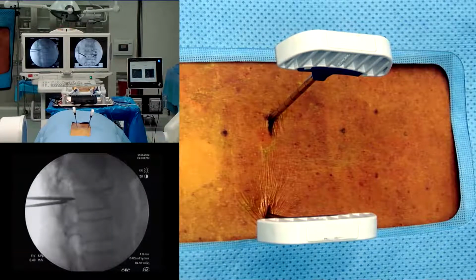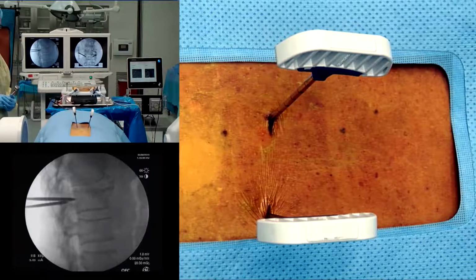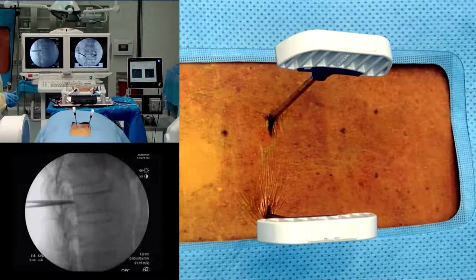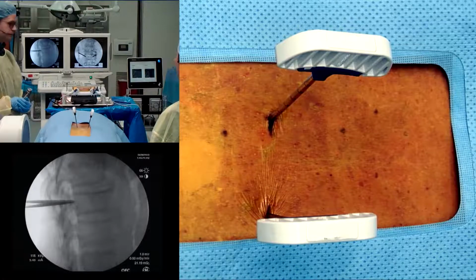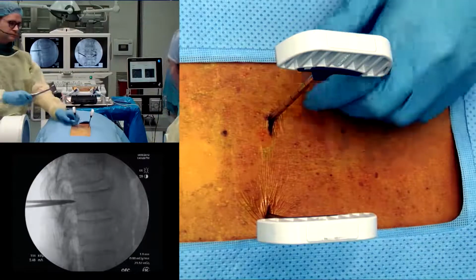Okay, and then can you change your wag just a little bit this way? Yep, and then come down south, a little bit more. Come down south, and go ahead and picture that. That looks great. Okay, so that's a much more true lateral view. Picture that again. And then we're gonna go in probably about another centimeter or so, both of us.